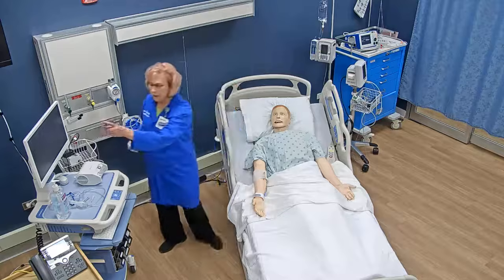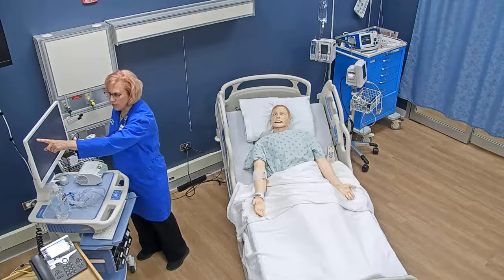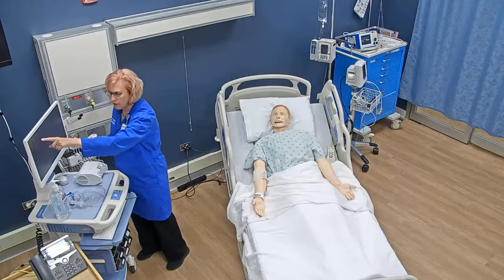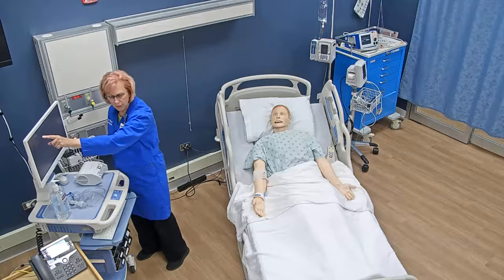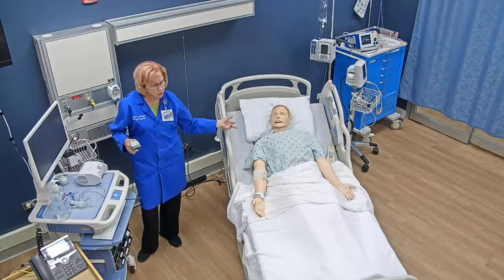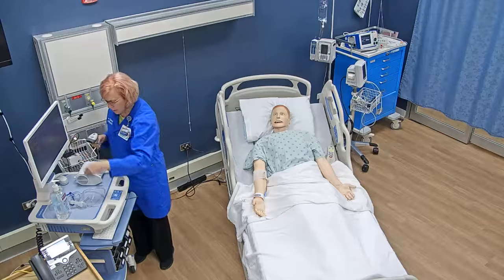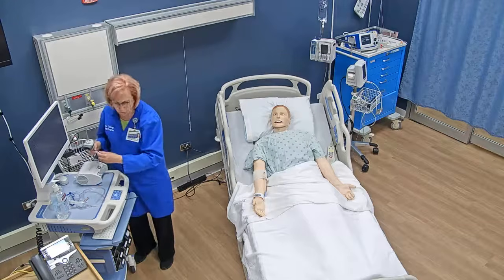I also look at his EMR, the medication administration record, and I verify it says Williams, and his date of birth is 12/12/19XX. And I ask my patient, sir, do you have any allergies? And he tells me no, he has no allergies. I verify that on the MAR. Now I am going to check my medication.